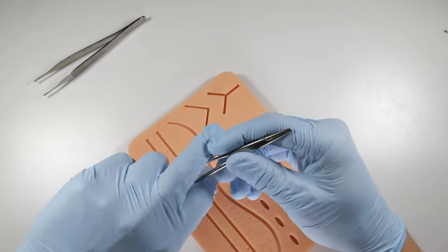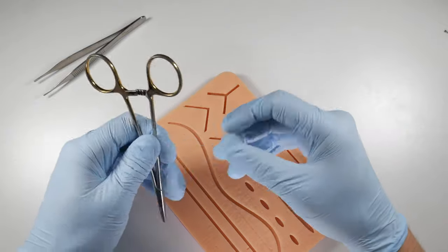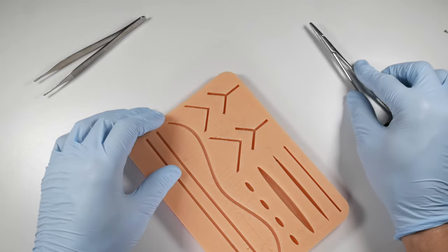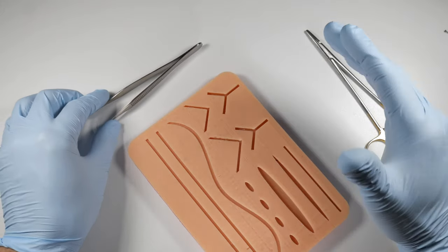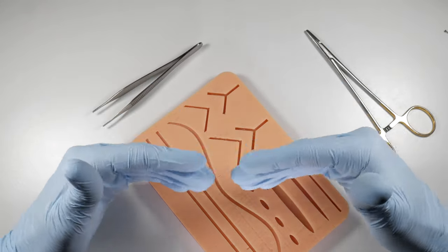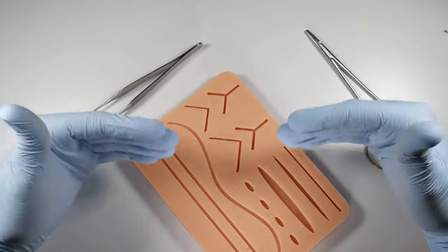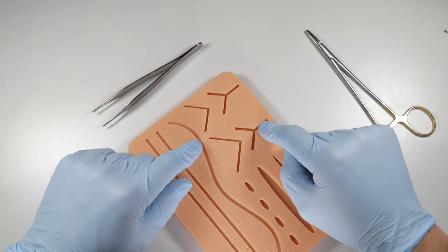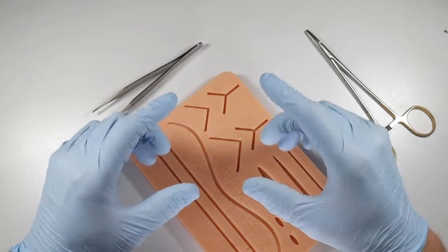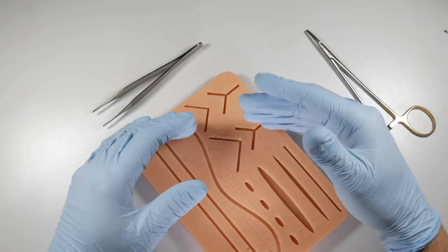I've never been quite so brave as to suture an extra oral laceration. I usually pass that along, and I would suggest that you do as well. So these are some cool tips for suturing. We're going to cover way more in the coming videos. Just stick with it. Watch some of these videos. You're going to be really good at suturing by the time you're finished this. Certainly confident enough to tackle anything that involves a flap to remove a tooth.